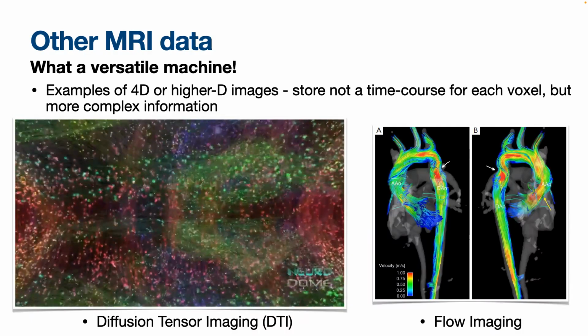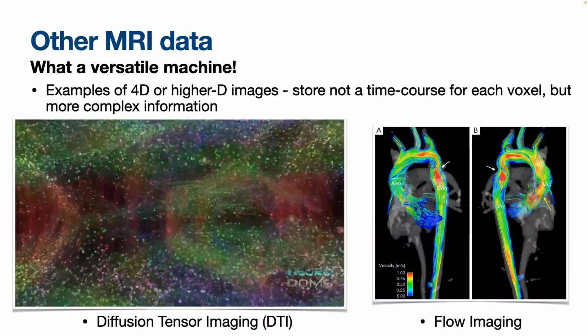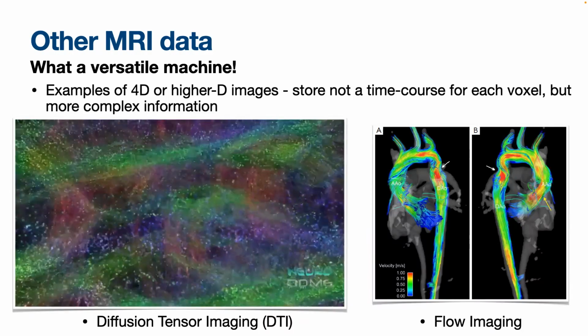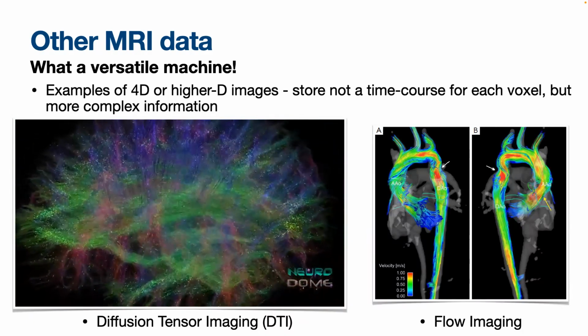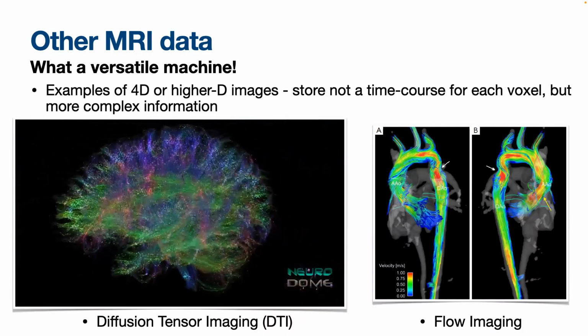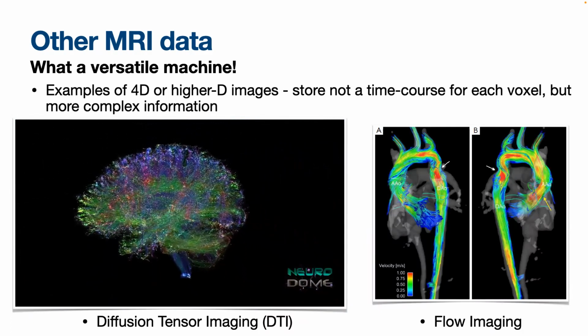Does the MRI take a voxel every interval, or is it all in one go? That depends on how you're using the scanner. Certain types of data that you acquire will actually be per slice, so you acquire an image per slice. You run through what you might call pixels, but they are not pixels. You get into the mathsy, physicsy side of things. It's about how you can encode space using just frequencies of radio waves.